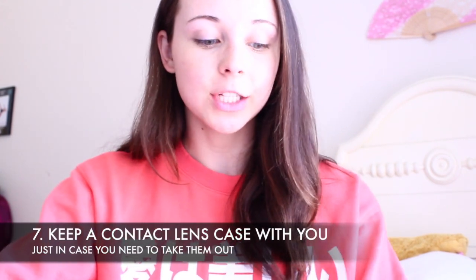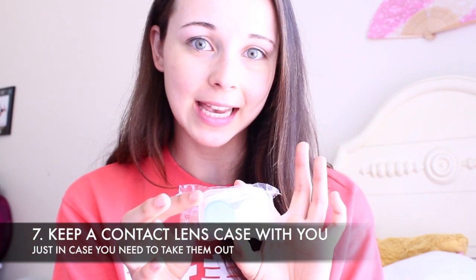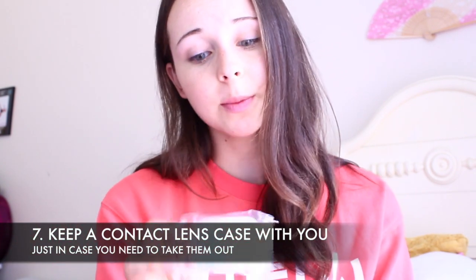The next tip I have is to always carry one of these with you. So these are just contact lens cases. TTD Eye gave me this one, and these come in handy if you have any sort of problem. So if something were to get into your eye or something's bothering it, you want to take them out, instead of just having to throw your contact lenses away, having these in your back pocket with some solution maybe, because then you can just keep them safe until you want to wear them again.